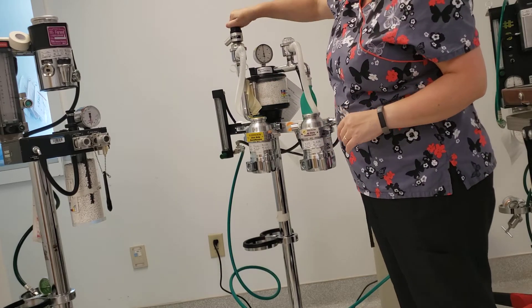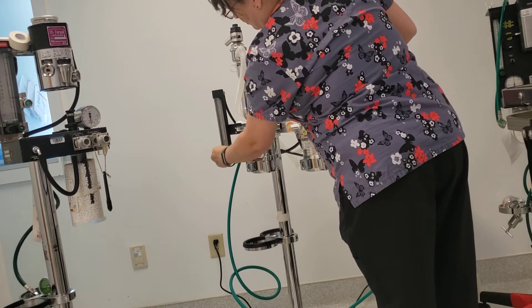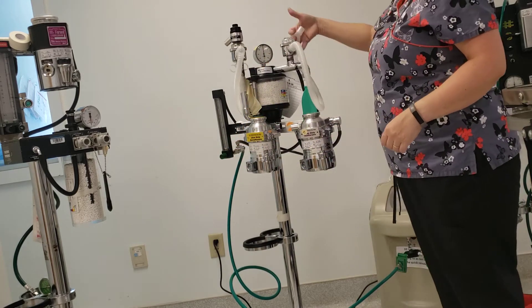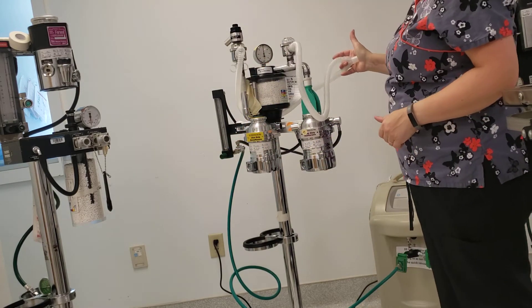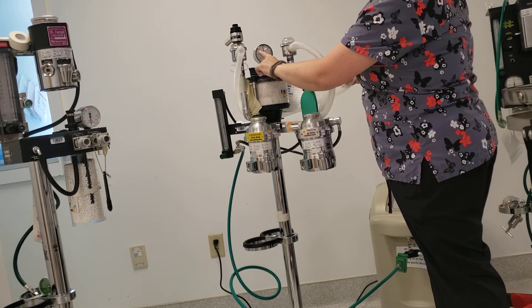I'm going to close my pop-off valve. I'm going to turn on my oxygen. And I'm going to occlude the breathing tubes with my hand. You're going to watch your manometer until it reaches 20.